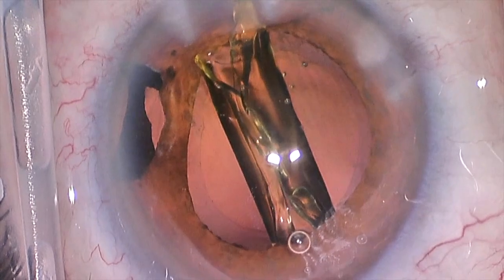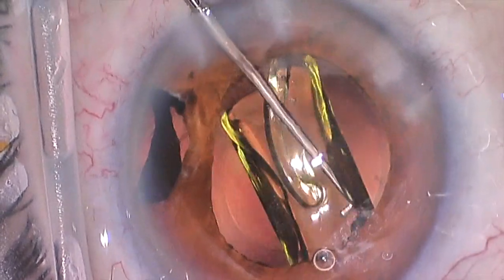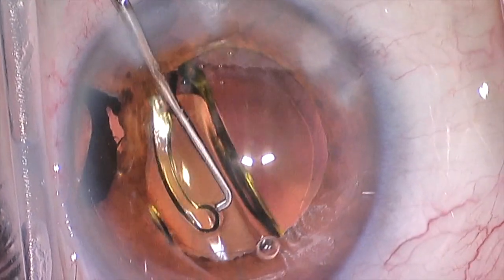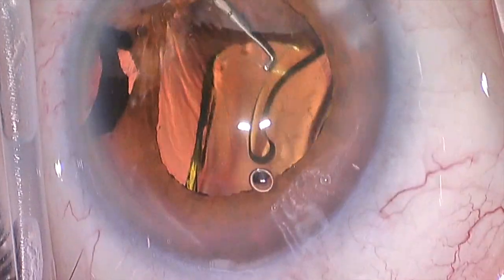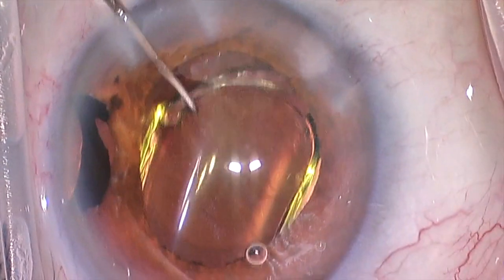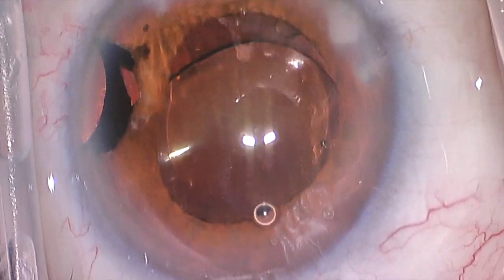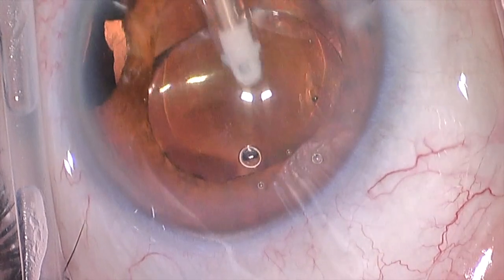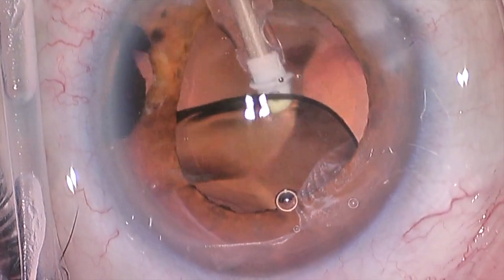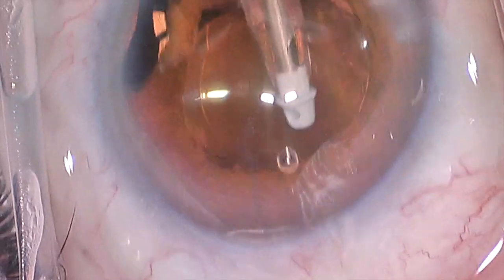Now that the anterior capsule has been swept, we put our lens in. The lens is preloaded and injected in one piece. It goes into the eye through approximately a 2.4 millimeter incision, and then the lens unscrolls in the eye. We use what is called a Sinski hook to open up the lens. I try and free up both haptics or arms of the lens and get them to expand so that I have a good idea of exactly where the lens is going to sit once the case is done. These are technically self-centering lenses, so they should center very well without much assistance. I do try and expand the lens as much as possible before removing the remaining viscoelastic material.